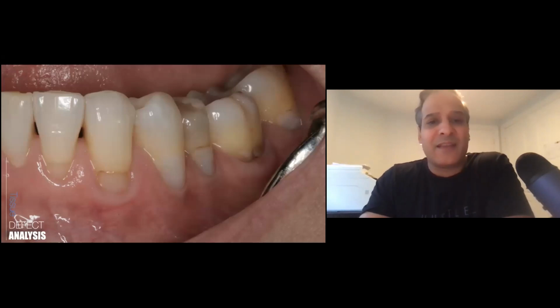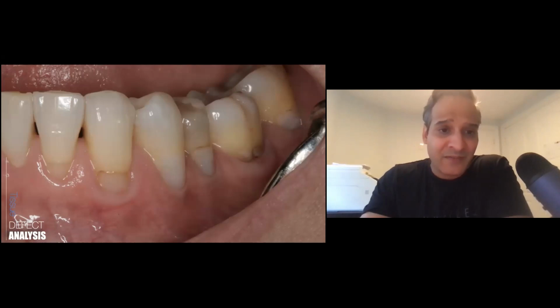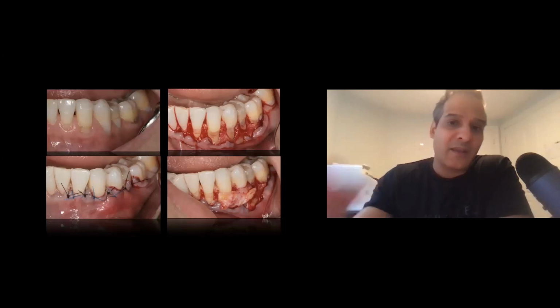Patient came in, they just didn't like the way the teeth look. This is more of an aesthetic issue, but what I see is minimal keratinized tissue. I see class 5 restorations that were used, I guess, to seal up root sensitivity due to the recession. So, cases like this, guys, always offer a root coverage procedure first before you do this, because most of the time these just get worse and worse over the years, and then it's harder to fix.